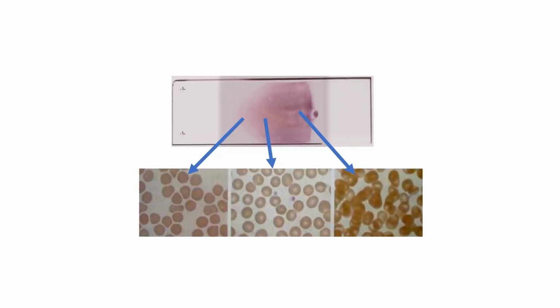Now, as we can see here, at the head side, you see a lot of cells which are clumping, which are on top of each other. So when you see something like this, don't panic. You can just go towards the body and towards the tail, and eventually you will find cells which are not really overlapping and are spaced apart from each other.